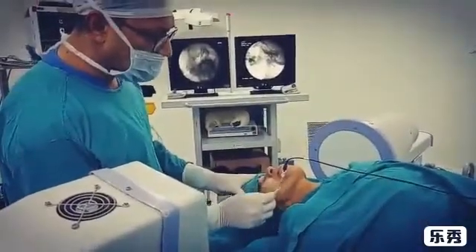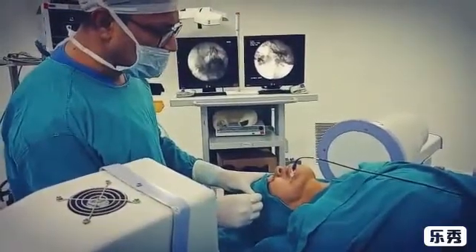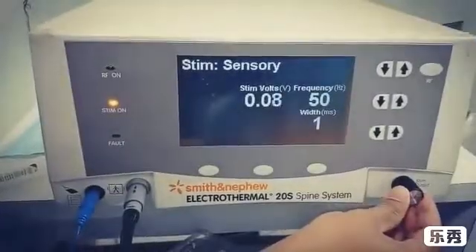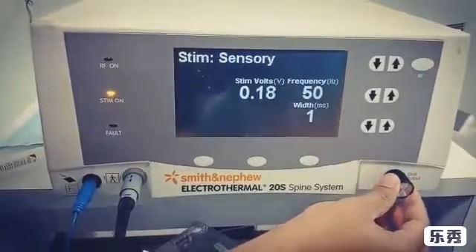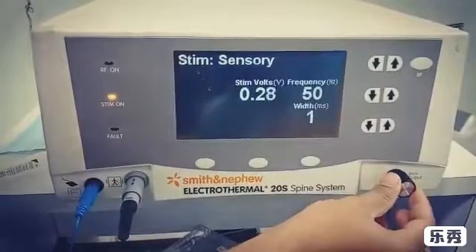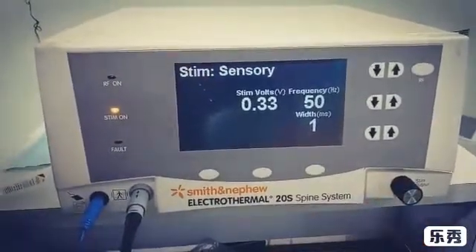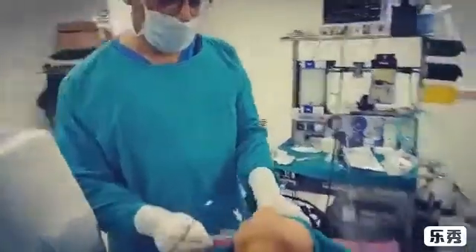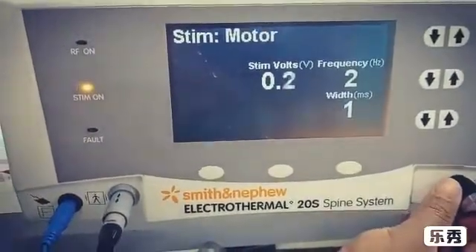Now we go for the stimulation. Let's go for the motor stimulation.